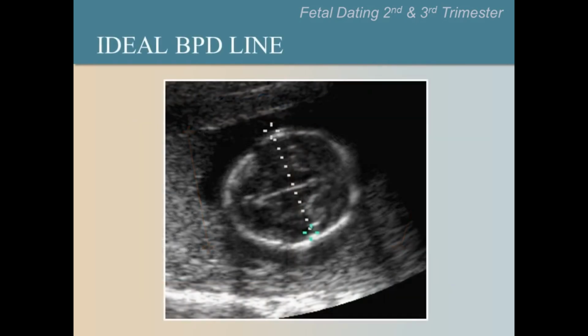This fetus is only 15 weeks and 5 days. Can you see the thalamus and CSP? Please pause the video now to look for these structures. It can be very difficult to see the CSP before 18 weeks.